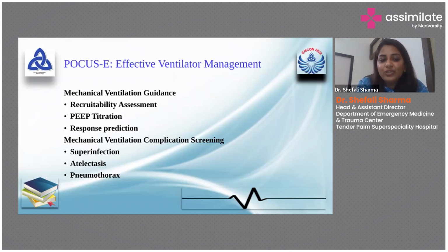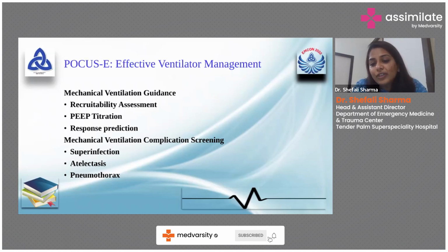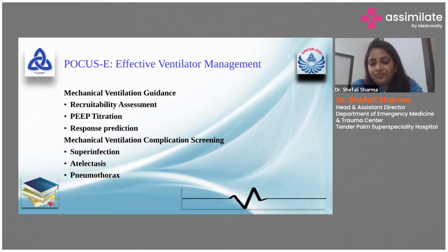You definitely have to check what is going wrong. Did the patient have a pneumothorax, or ventilator-associated lung injury, or barotrauma, or is there a mucus plug or bronchus plug and the lung is not getting ventilated? Instead of waiting for the X-ray technician to come, do the X-ray, and then share the film with you on the PACS, you can just put the probe on the lung and see what happened.